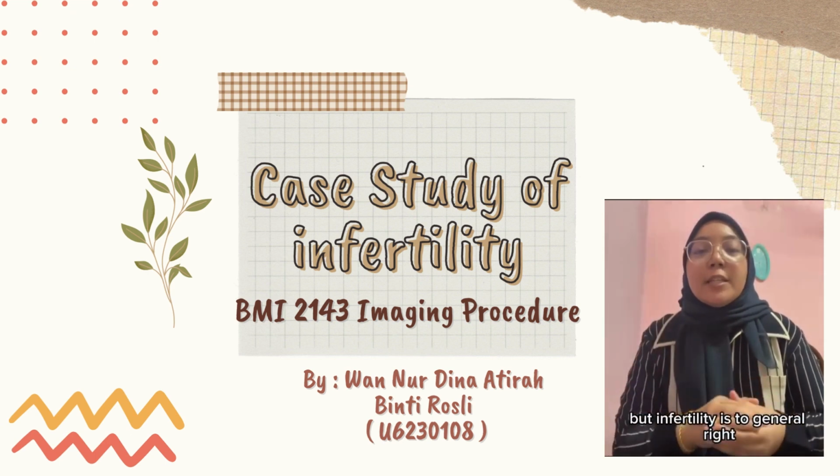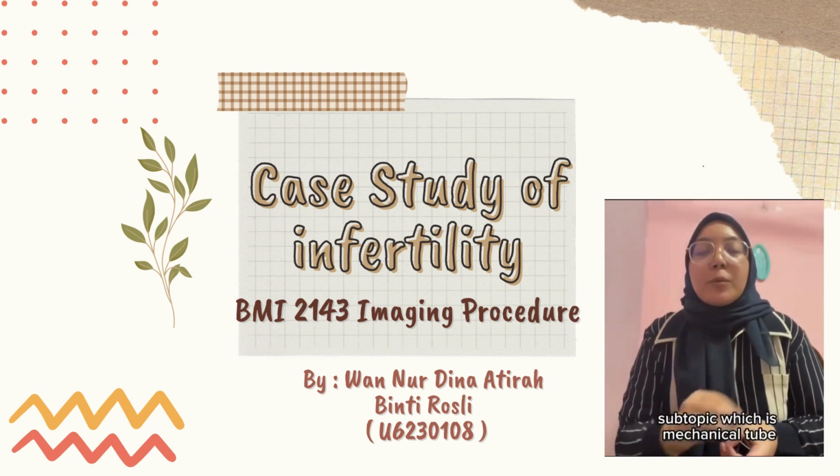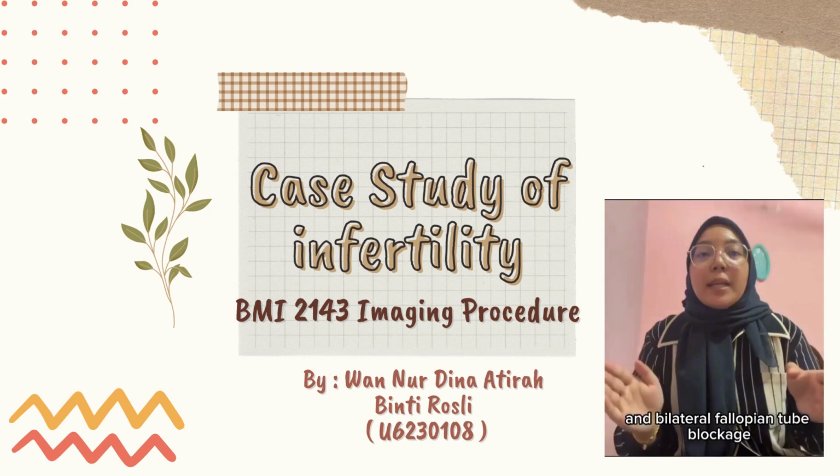Today, I would like to share my case study that I choose, which is infertility. But infertility is too general, right? So let me give a very specific subtopic, which is mechanical tube occlusion device and bilateral fallopian tube blockage.